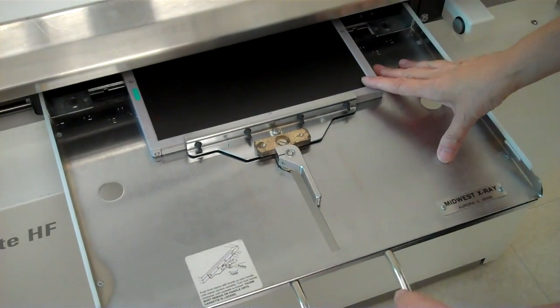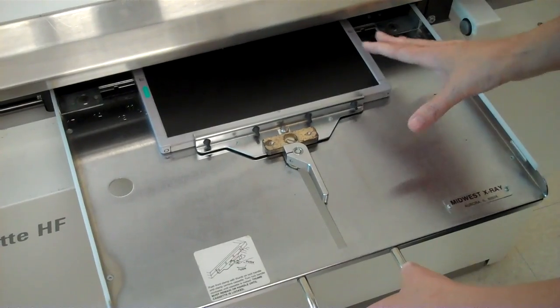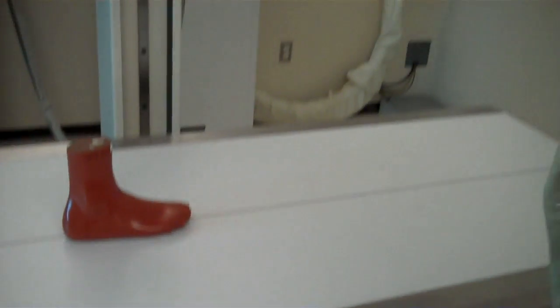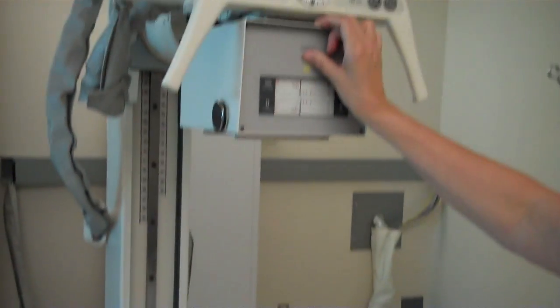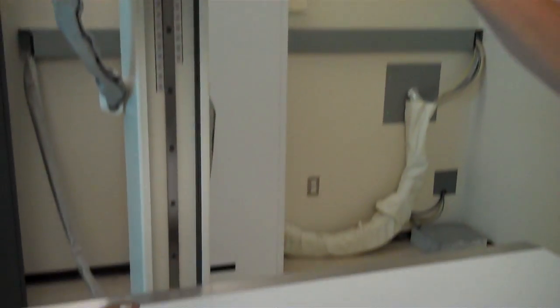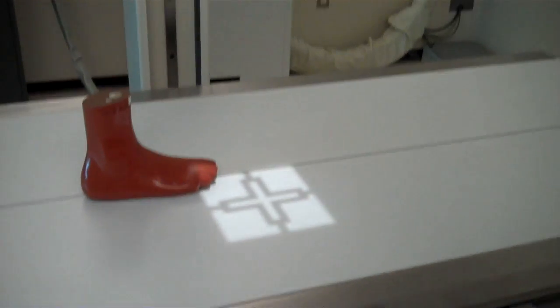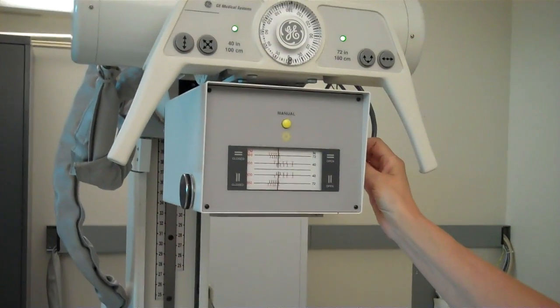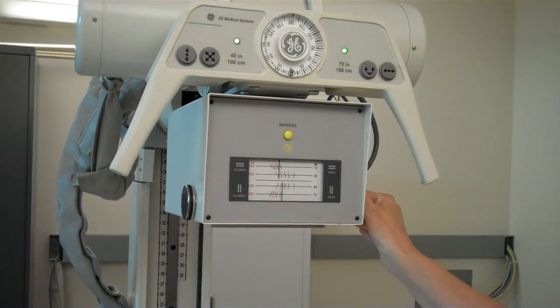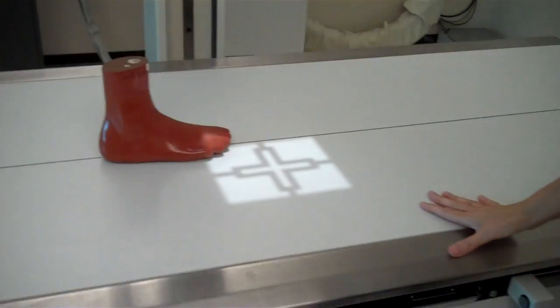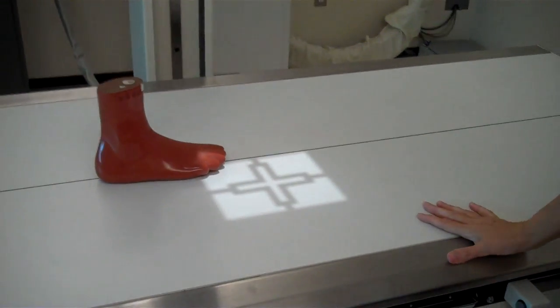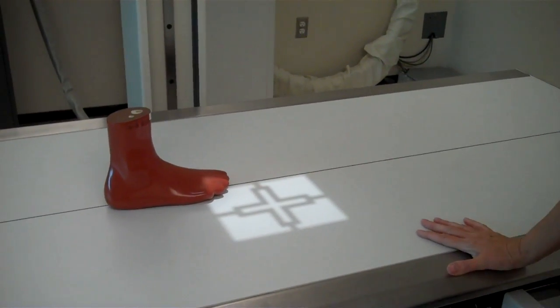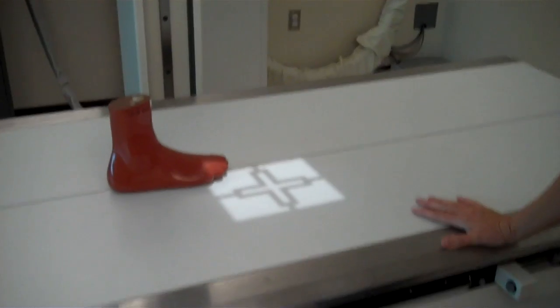We've placed our image receptor in the bucky tray and centered it. We have 40 inch SID and we've adjusted our collimation for our eight by ten. Now we want to move the table top and take the part and align it to the film.